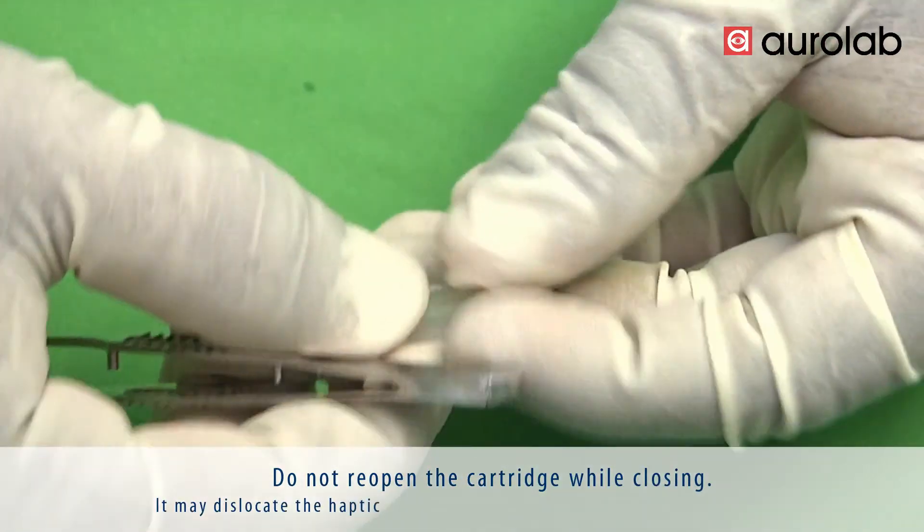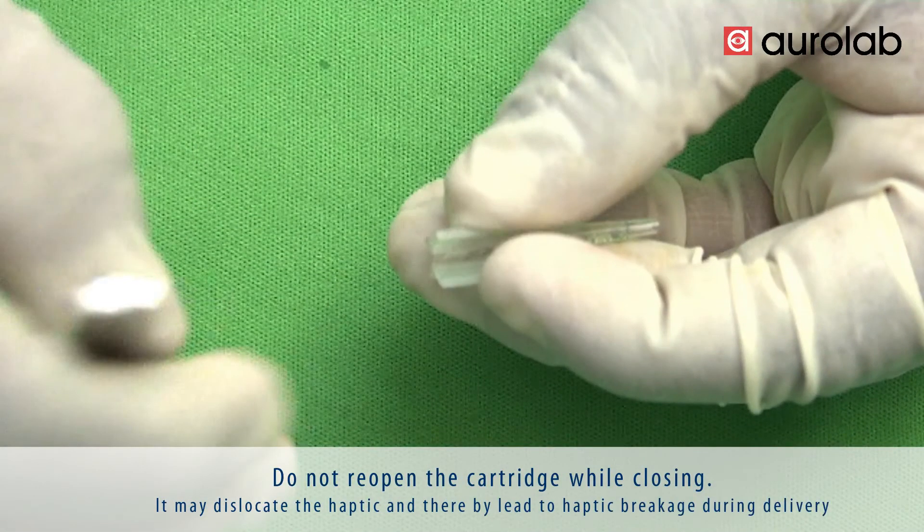Do not reopen the cartridge while closing it, as this may dislocate the haptic and thereby lead to haptic breakage during delivery.